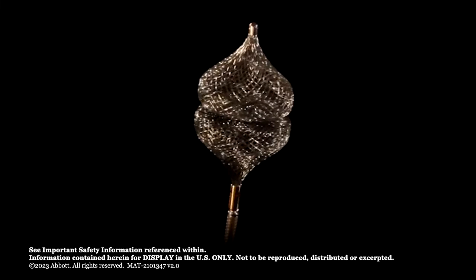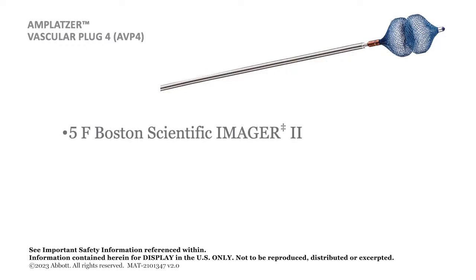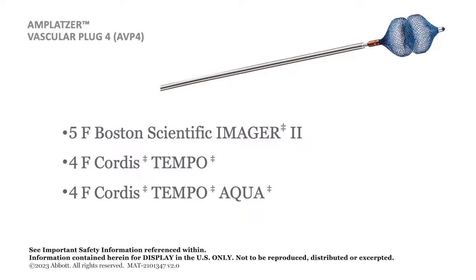The AVP-4 has been tested for compatibility with the following diagnostic catheters: the 5 French Boston Scientific Imager 2, the 4 French Cordis Tempo, the 4 French Cordis Tempo Aqua, and the 5 French Merit Medical Impress. The use of other diagnostic catheters may result in an inability to deliver, deploy, or recapture the device. Refer to the manufacturer's instructions for use, as the manufacturer may make changes without notice that may impact suitability for use with the Amplatzer Vascular Plug 4.